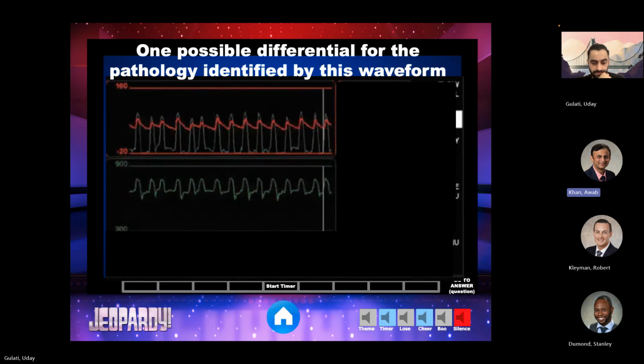If the motor current is having variations. So I'll give you guys a clue. Look at the motor pump waveform, which is the one in green, and then analyze the waveform itself. There's obviously something wrong compared to what it was before.